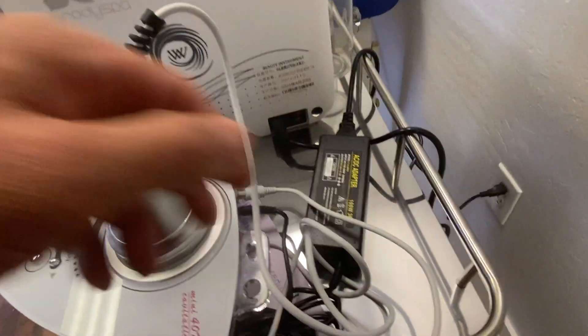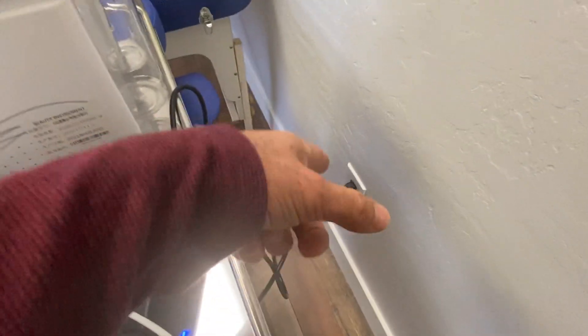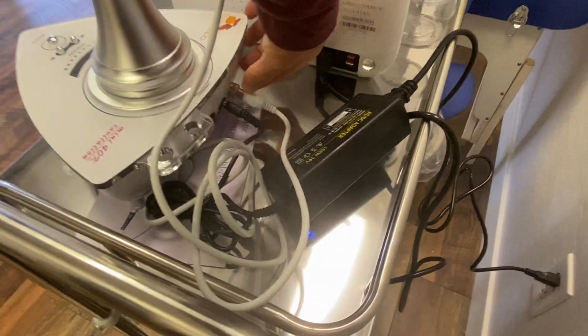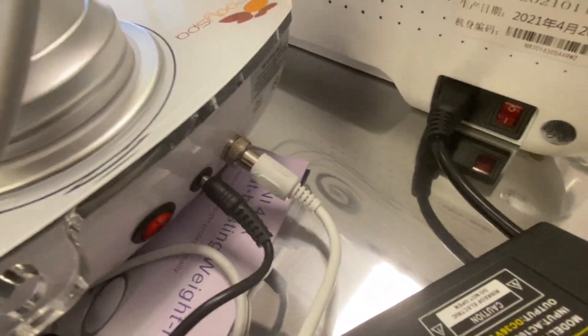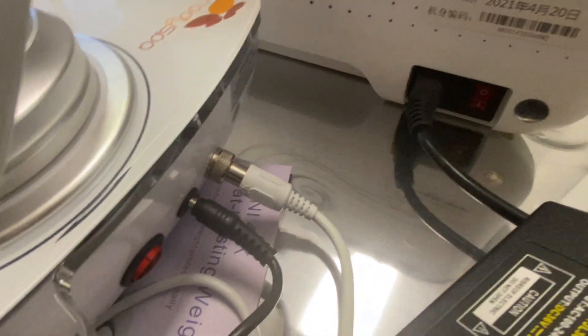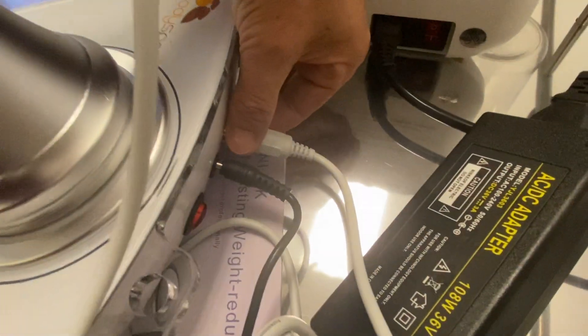The first thing you want to do is make sure you're all plugged in properly with your adapter. You want to use a surge protector. You want to make sure that this piece right here, which is really important, has a groove in the bottom and then slides in here. If it doesn't go through that groove, it won't go all the way in, so this adapter piece would not work if it's not fully connected.